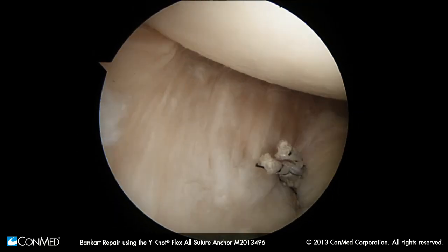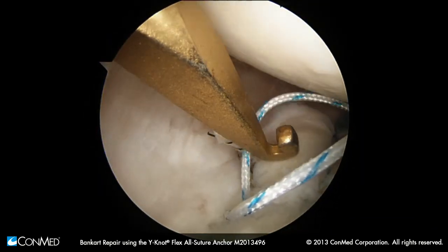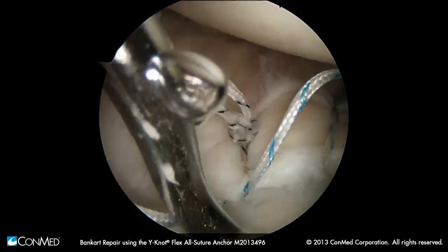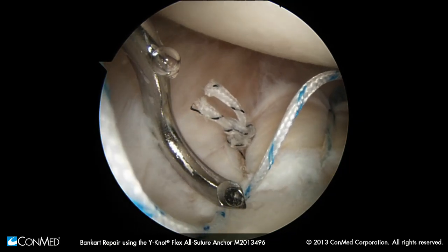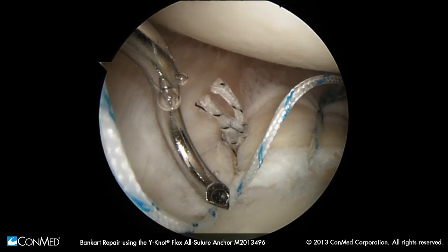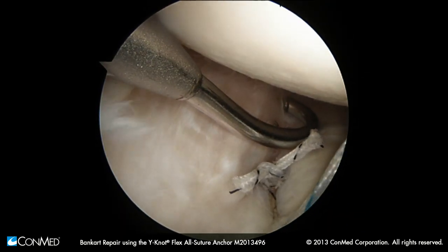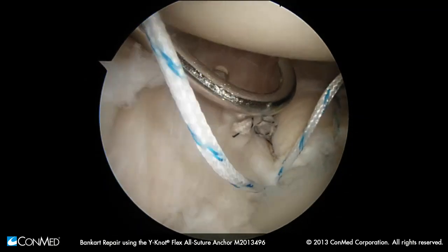Now we'll take our crochet hook and put another one in. I'm looking at these two and say: I want this limb here to go through the labrum there. I'll leave that in the posterior portal and pull the other one out. We'll get our same 45-degree to the right and repeat. Now I look at this and say: I've got two sutures here. I don't want them right on top of each other — I'd like to get a little spread in between. I've got a couple of options. If I don't like my tension here, I can get a bigger bite along the same line and pull this suture up and over the top of the first one in patients with more significant laxity.